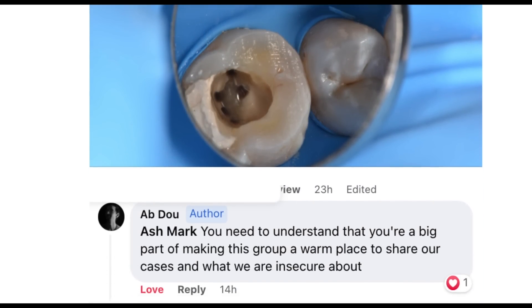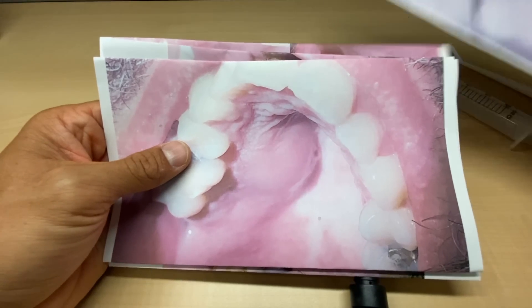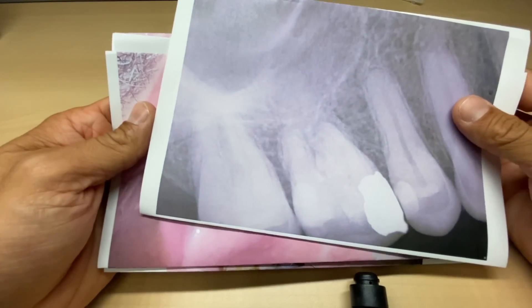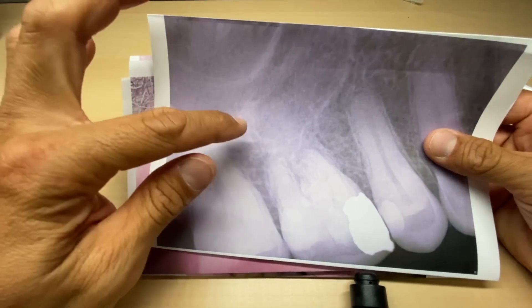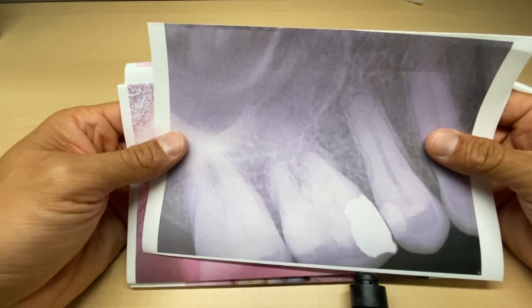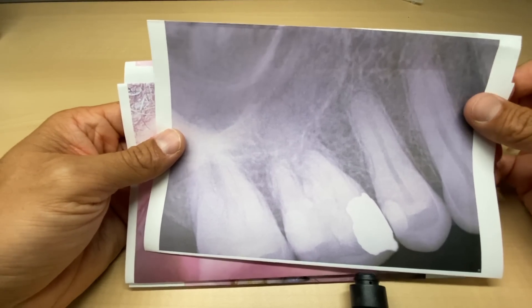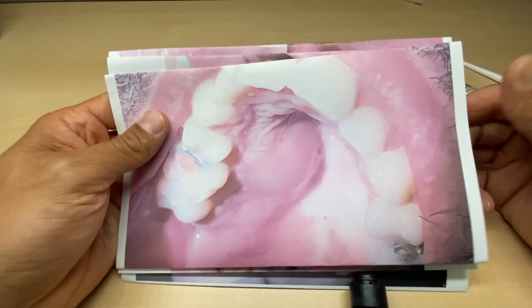Back to the show. When we take a look at this periapical radiograph, we know there might be a lesion. There's probably some resorption and the palatal canal is going to be large. I want to address that right now.